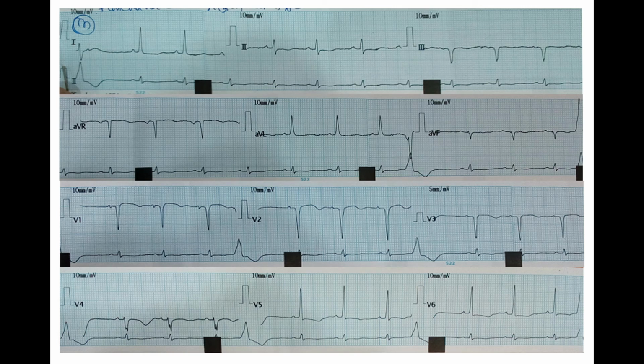It is not interchamber like in LBB and RBB. The impulse is traveling from one chamber to the other chamber, but it is not happening in left anterior hemi block. So the QRS is of normal duration, less than 3 small squares, left axis deviation, S wave in lead 2 and lead 3. So this is the criteria for left anterior hemi block.